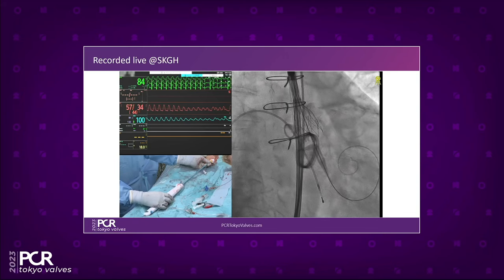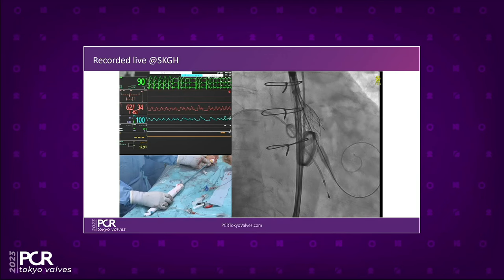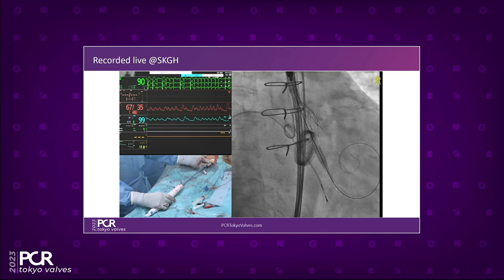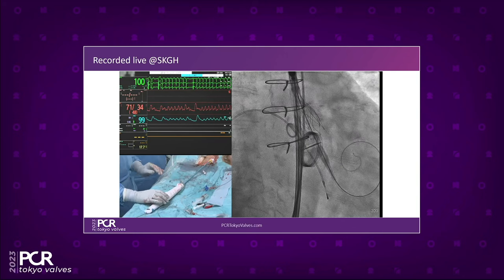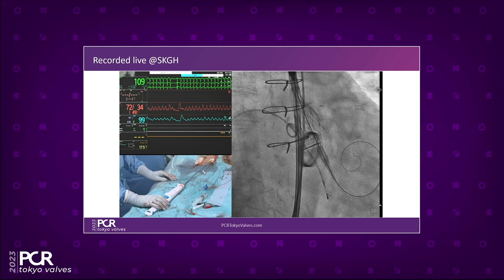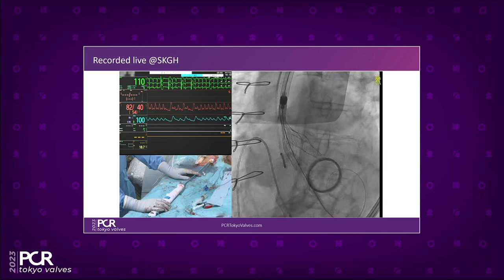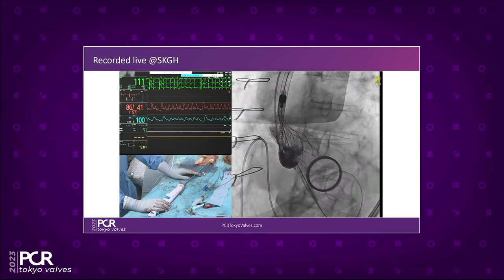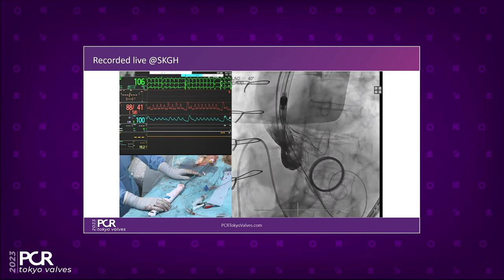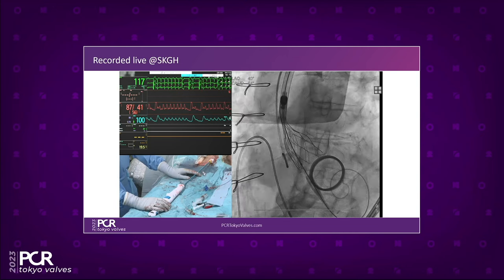During this procedure, did you do the rapid pacing? Ordinarily, we never use rapid pacing during Navitor deployment. So, Michael, why don't you need pacing with this valve compared to the Evolut valve? We usually would not do pacing when we deploy this valve because this valve is very stable and you don't see the drop in blood pressure usually, unless there is a lot of aortic regurgitation, then probably we will pace at 120.